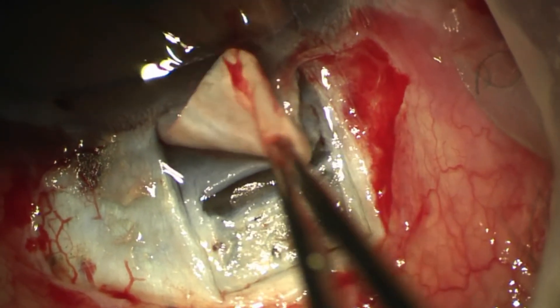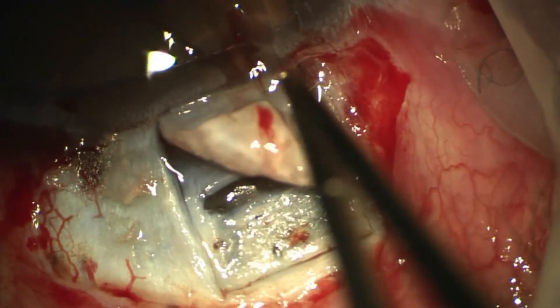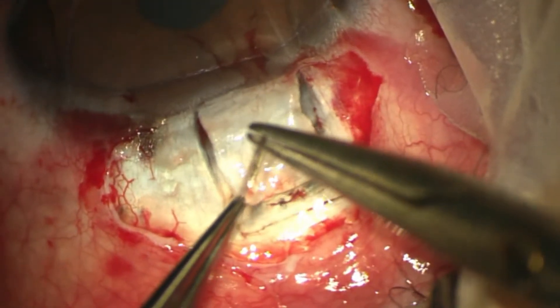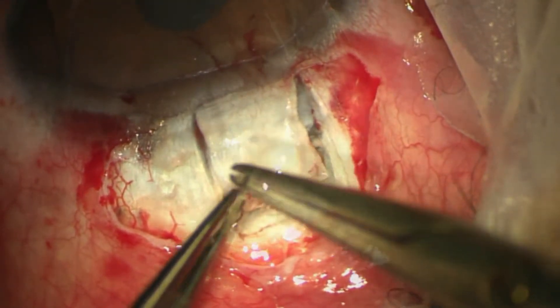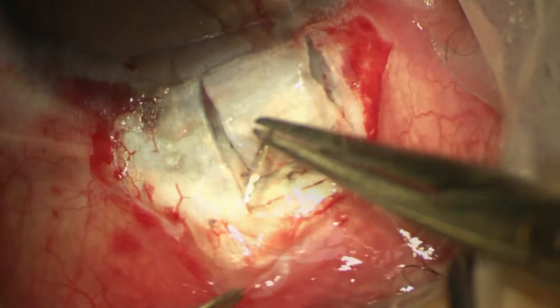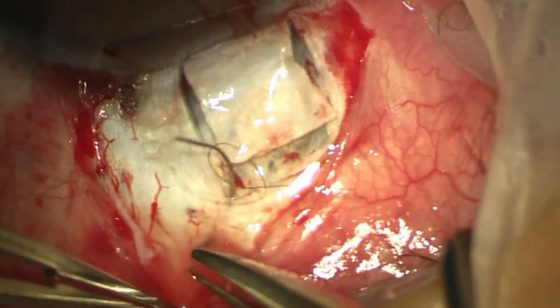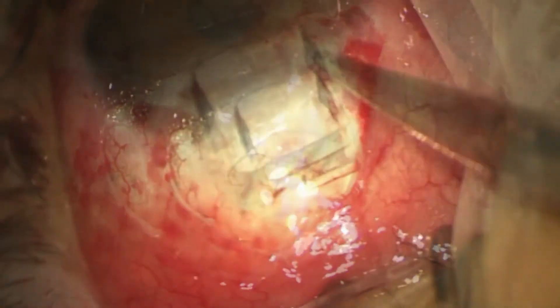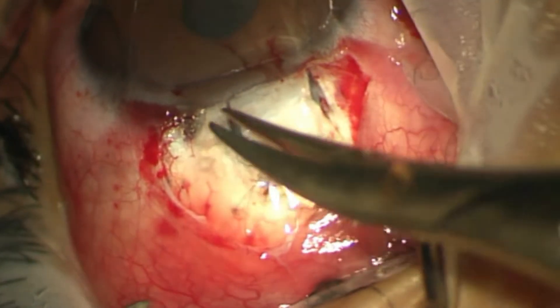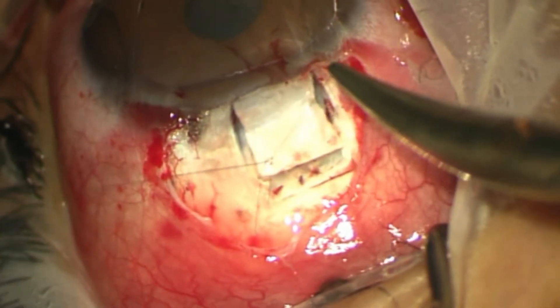We close the superficial flap with 10-0 nylon at both corners, keeping it loose to avoid any collapse of the flap that could limit filtration in the future.